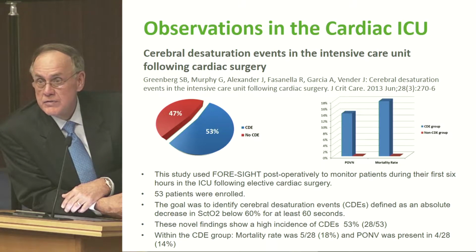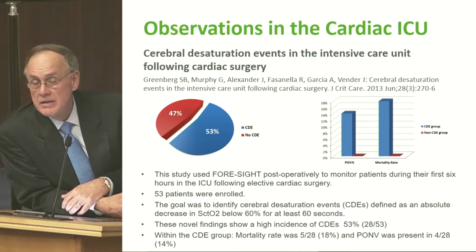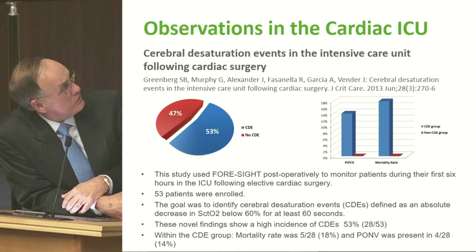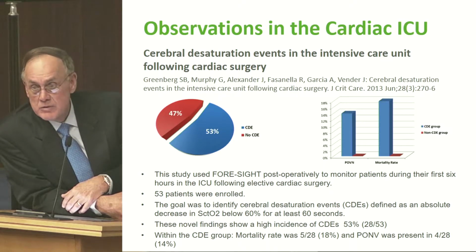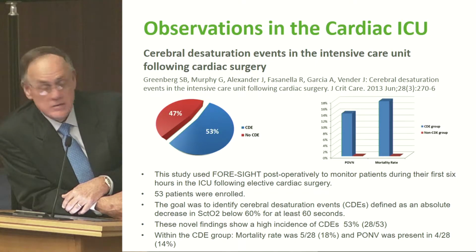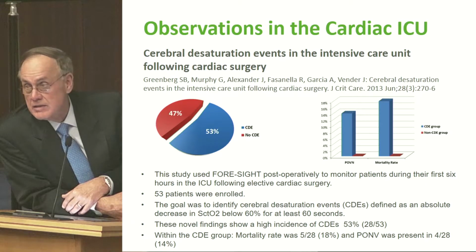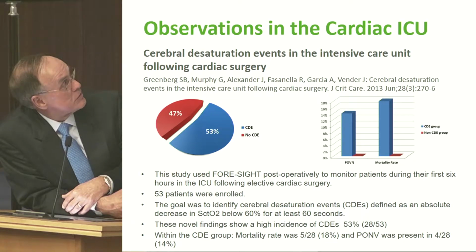This is for those of you that are intensivists, this is a very interesting study that was done on post-operative cardiac surgery patients. And you can see in the immediate post-operative period, 53% of the patients experienced these cerebral desaturation events or hypoxia in the intensive care unit. 47% did not.